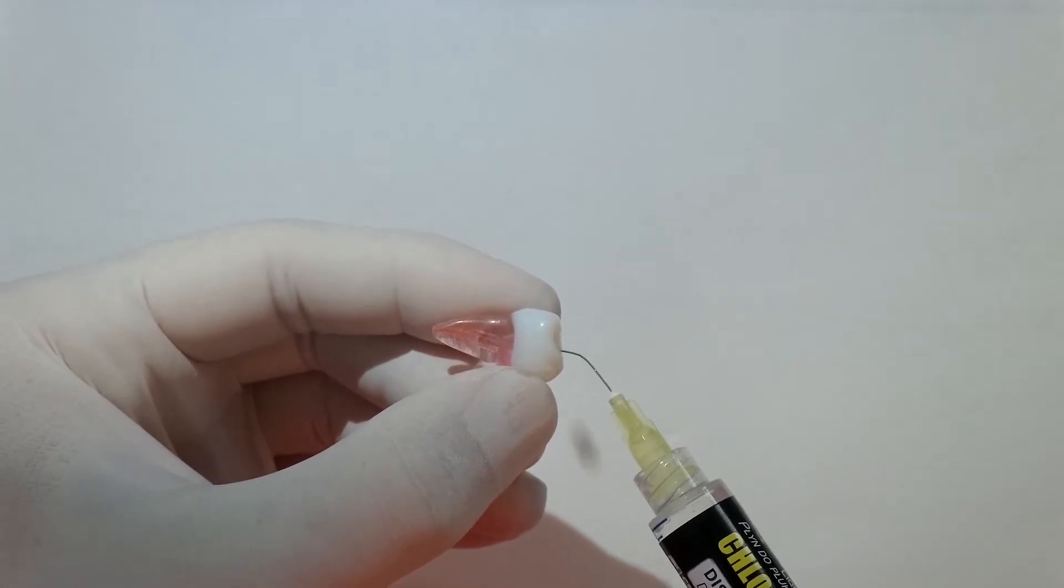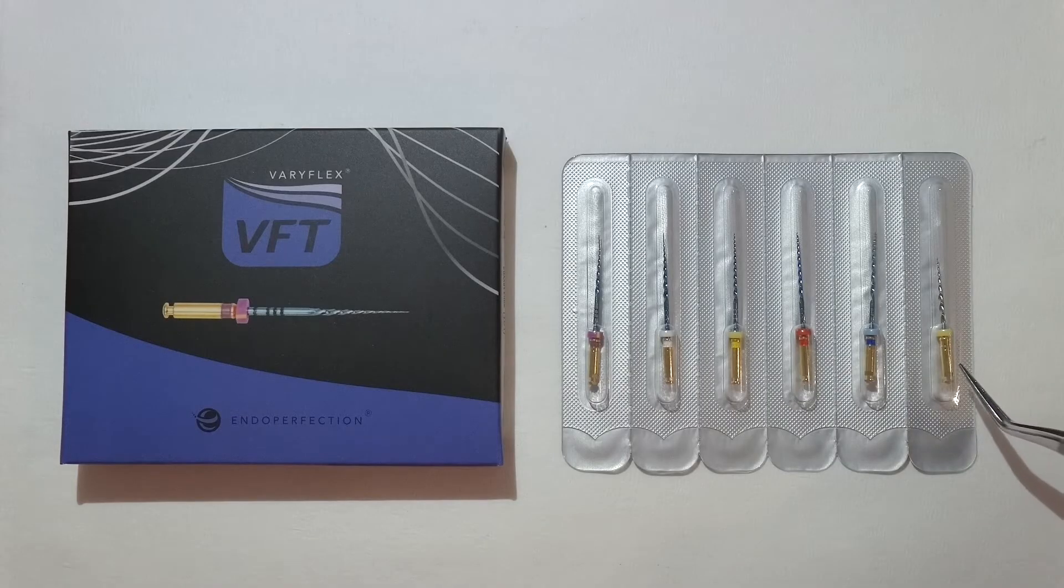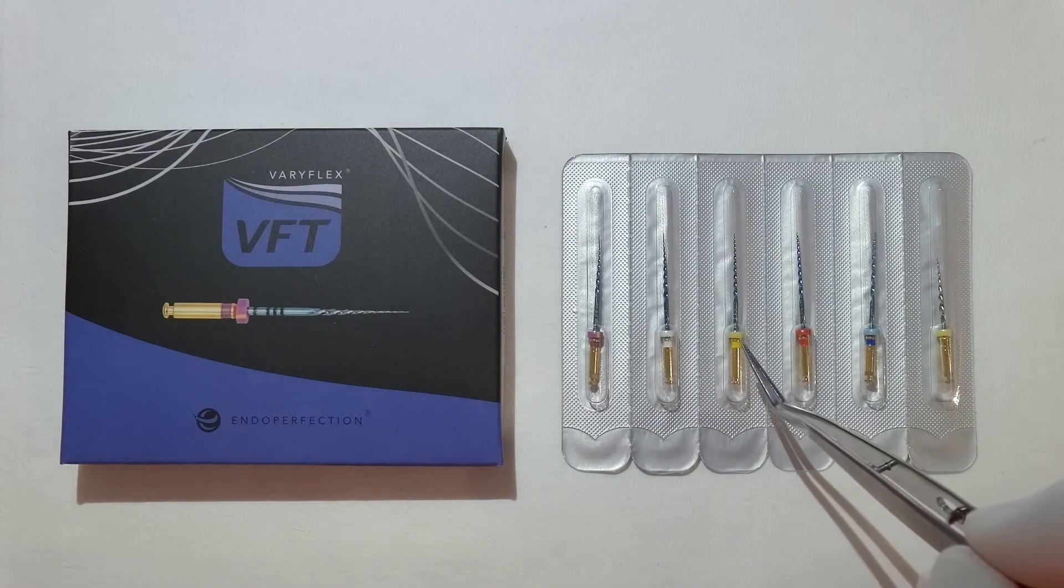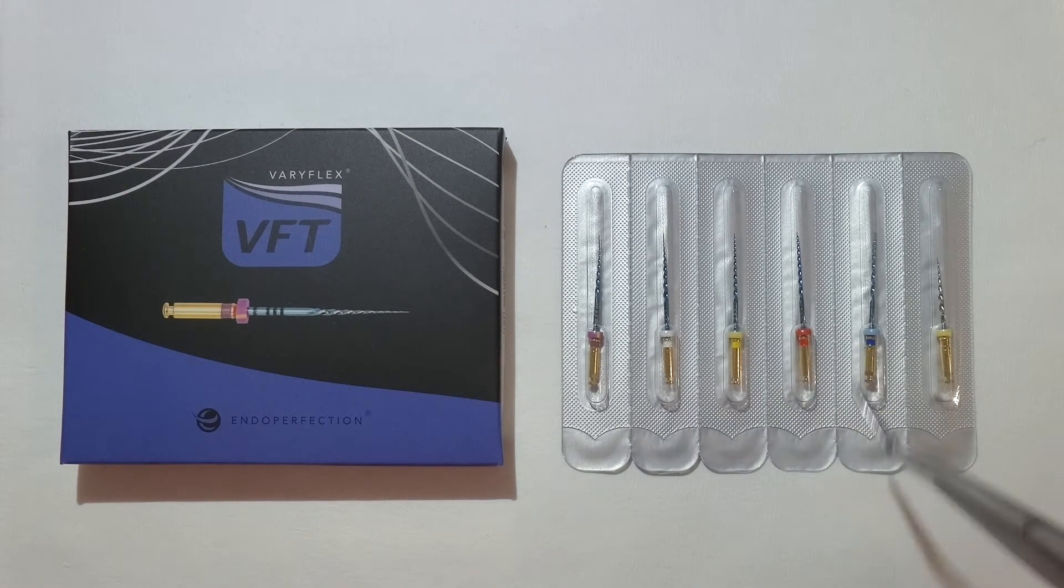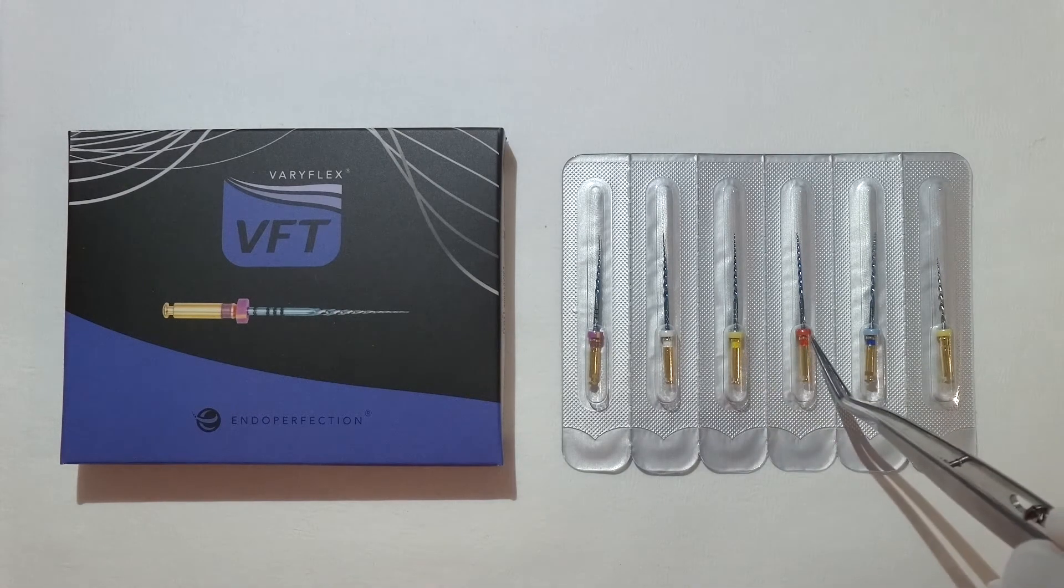Now we're going to use the VFT range. There's the SX right at the very end, we won't use that here. Then we've got the purple, white, yellow, red, blue. We've got the S1, S2, and then our finisher files: the yellow, the red, and the blue to finish with.